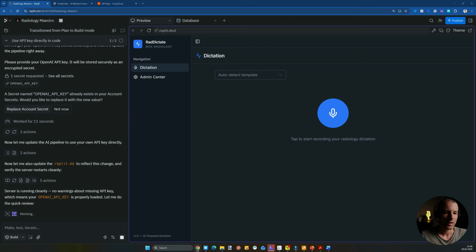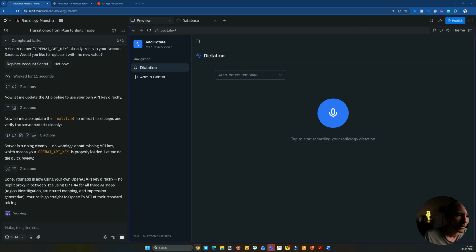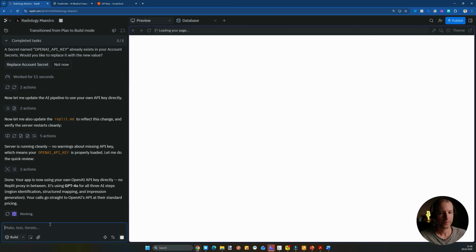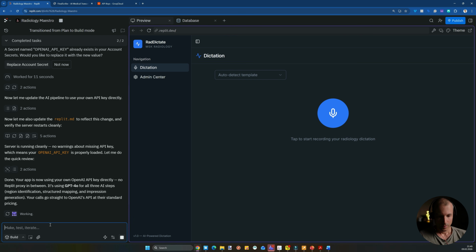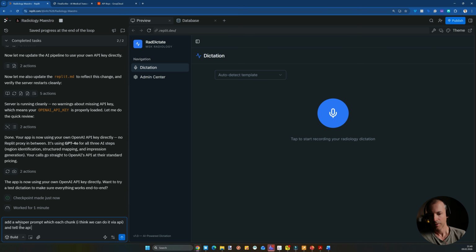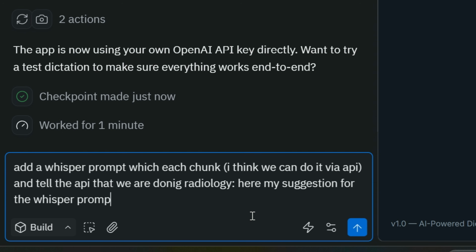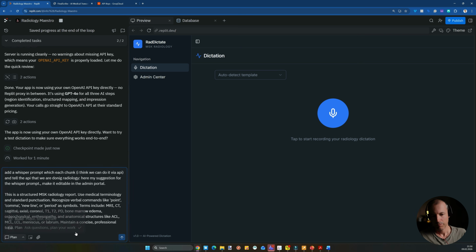Oh, and one thing I forgot is we need to give the Whisper prompt with it. Okay, that's good. So we have OpenAI set up correctly. I want to say to add a Whisper prompt with each chunk. I think we can do it via API and tell the API that we are doing radiology. Here my suggestion for the Whisper prompt: make it editable in the admin portal. So let's build this out as well.